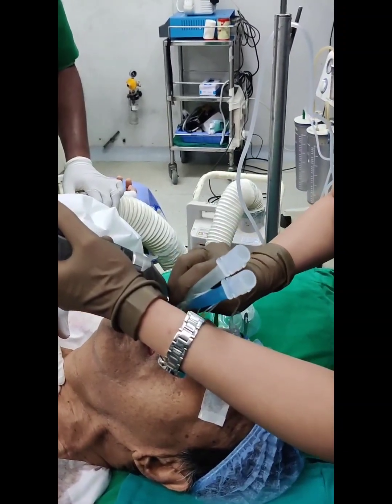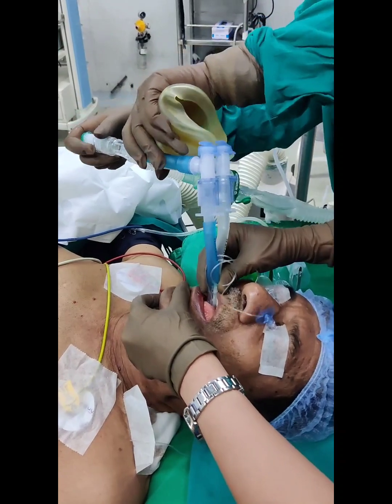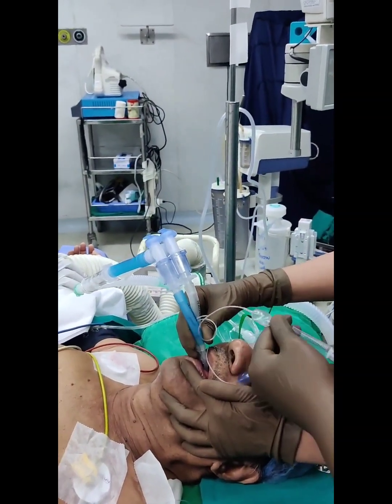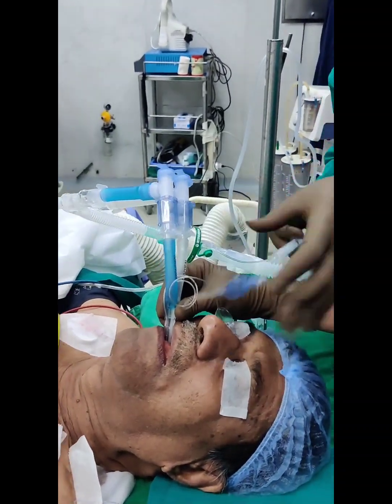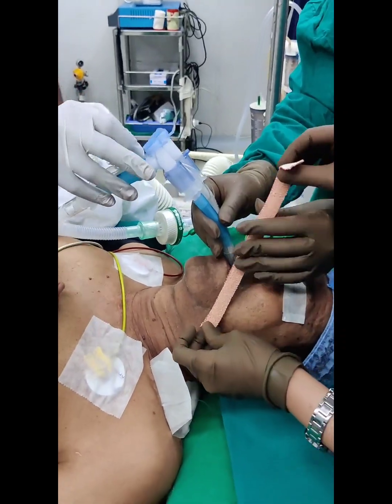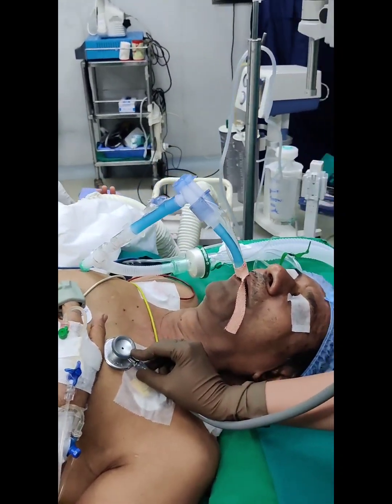Once the DLT is placed, connect the Y connector with short tube extensions and connect the ventilatory tubings to the Y connector. Inflate the tracheal cuff with about 8–12 ml of air; the bronchial cuff may or may not be inflated right away and requires about 2–4 ml of air. Secure the tube at the incisors or at the angle of the mouth using sticky tapes. Confirm ventilation by direct visualisation, bilateral chest movements, auscultation, and ETCO2 tracing.